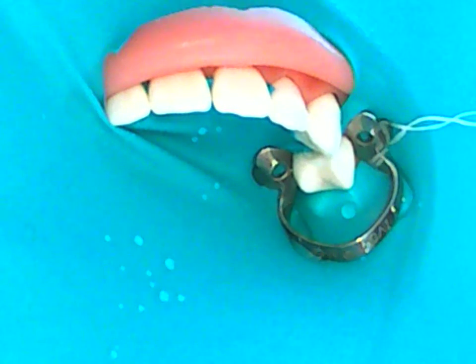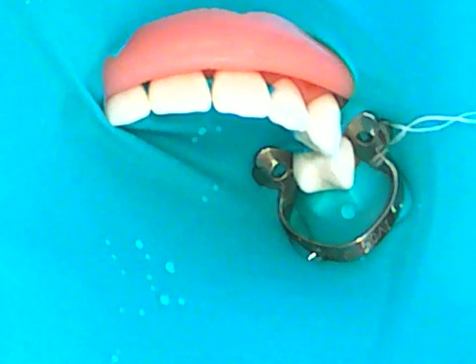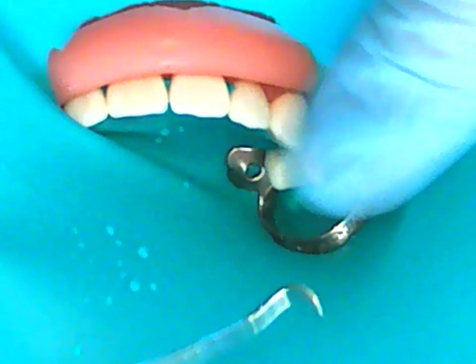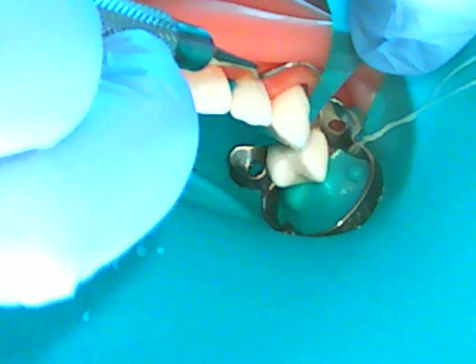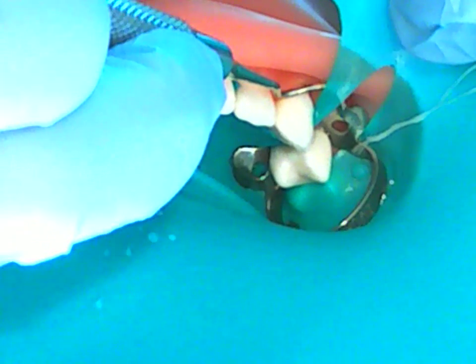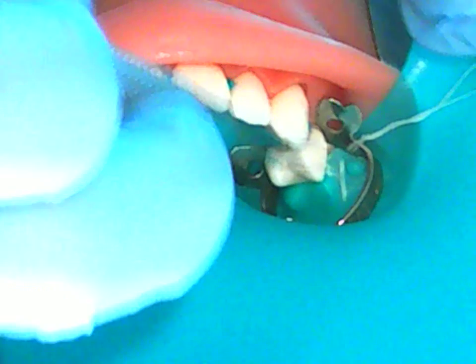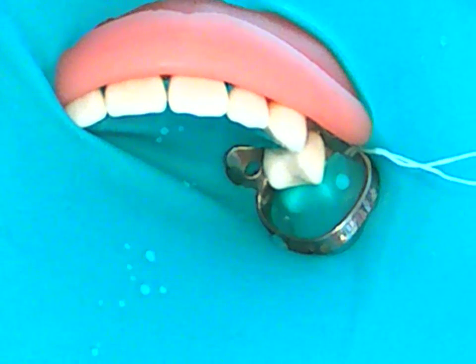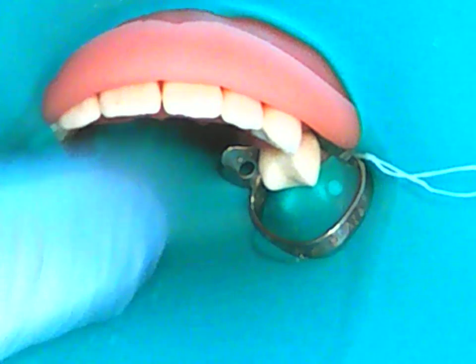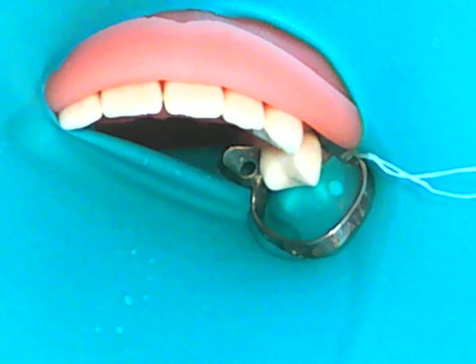And with that last one, we want to ensure all septa are cut. So, and I don't feel I can get to it with the scissors, I'm going to go to the scaler. I'm going to get him. Again, retract. Okay, you want to make sure your fingers are clear out of the way though. You don't want to injure yourself either. Get your scaler with the tip of the scaler pointed towards the occlusal. Okay, I have the scaler around the entire septum. Strong fulcrum with the instrument holding the scaler, and pull up and you cut your septum. Okay, loosen your septa from the lingual aspect. Everything's nice and loose. We don't want any reason for pieces remaining behind.